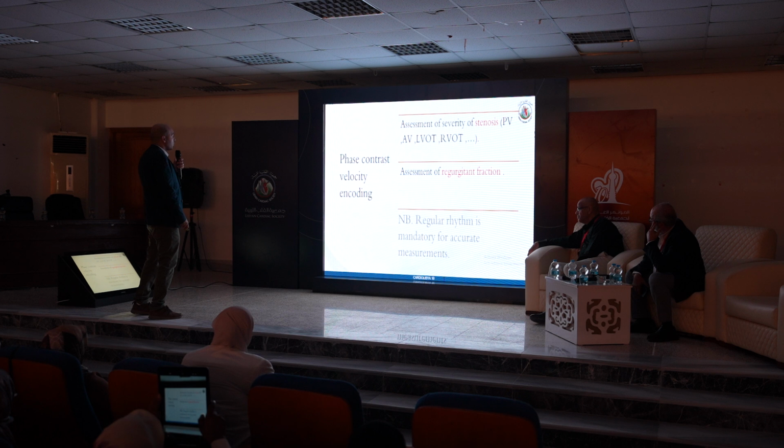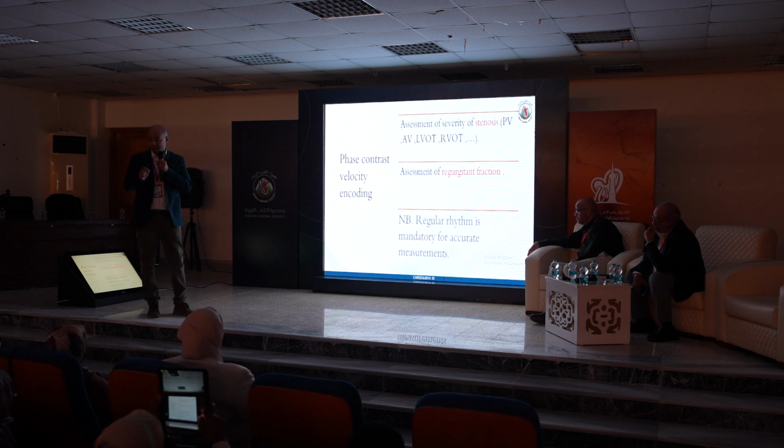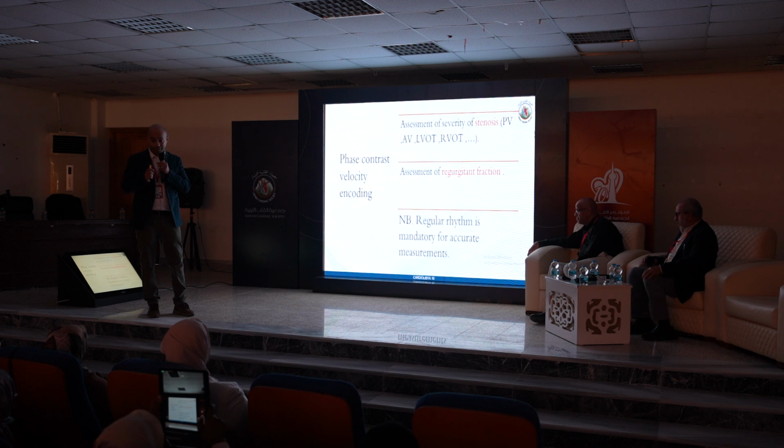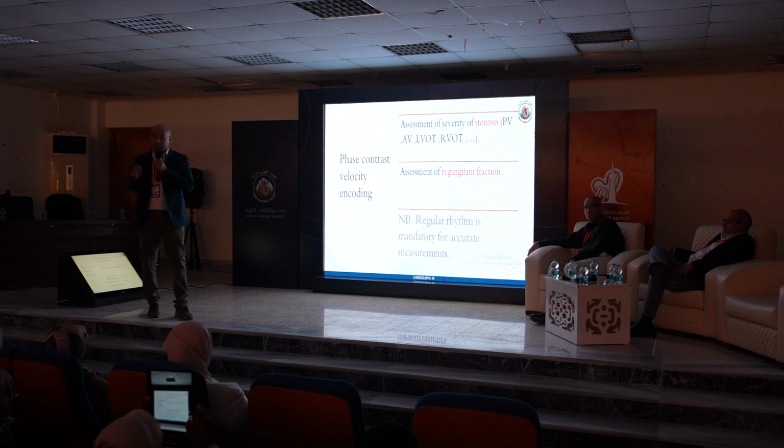Phase contrast velocity encoding needs a regular rhythm to get sound data. If the case has an arrhythmia, the acquired data will not be correct.